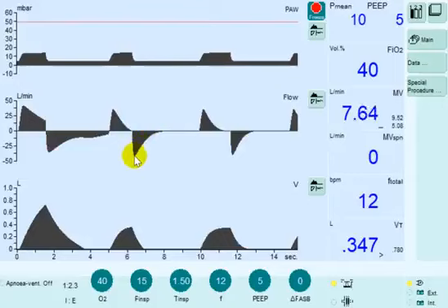You can see the expiratory flow waveform goes back to zero very quickly compared to the previous breath.